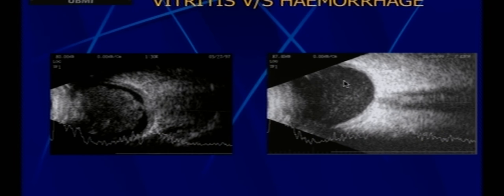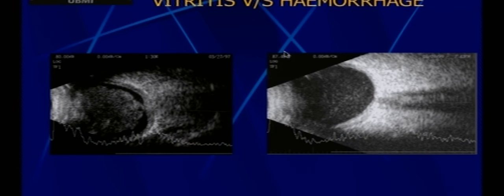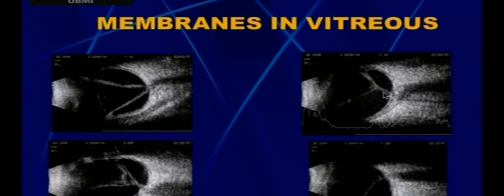A small amount of early hemorrhage can only be picked up by scanning the vitreous at high gain intensity. Look at the brightness difference between gain settings of 80 versus 87 — the minimal hemorrhage becomes apparent only at high gain. Now, regarding membranes within the vitreous: the key differentiation is between retinal detachment (RD) and posterior vitreous detachment (PVD). A uniform thick membrane attached to the optic disc with no after-movements is an RD. An irregular thin membrane with after-movements is a PVD. On A-scan, RD has higher reflectivity than PVD.